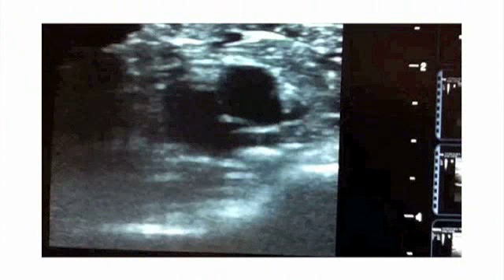What about this one? Compressing? Oh, did those walls touch? That looks pretty good. They did. That is, again, my beautiful popliteal vein. It's good to know you don't have a clot in there. It made me feel great.